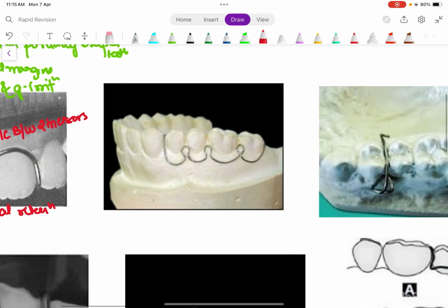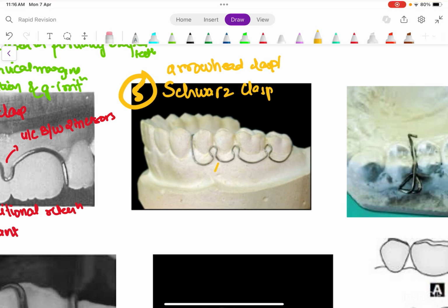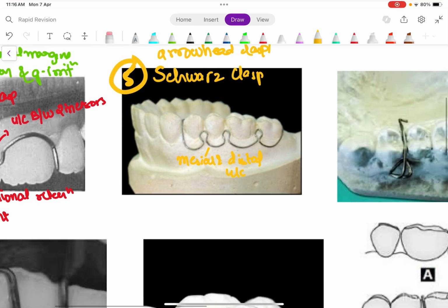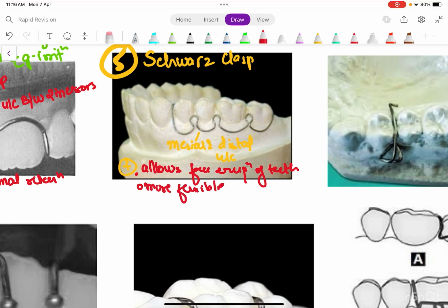Now let's talk about this one. Now, this is fifth. Now this is Schwarz clasp. It is also called an arrowhead clasp. Now this basically engages mesial and distal undercut. Advantage is it allows free eruption of teeth, more flexible. Disadvantage requires a special plier.